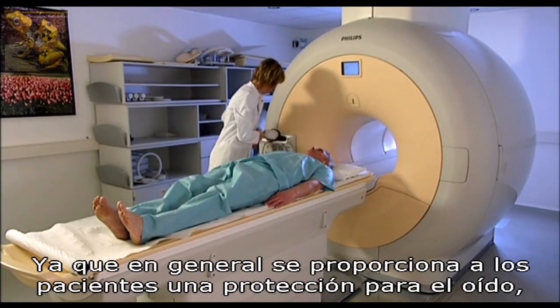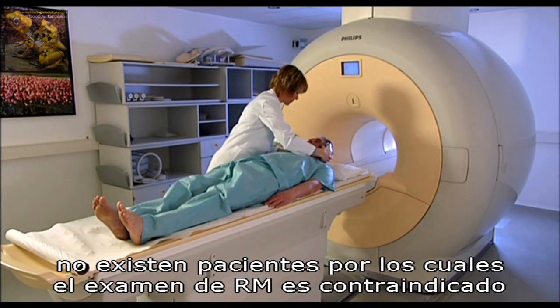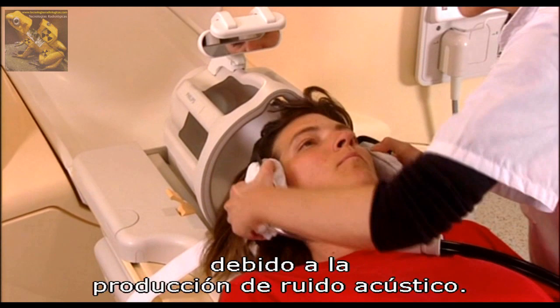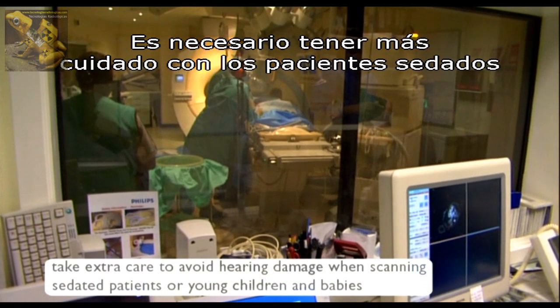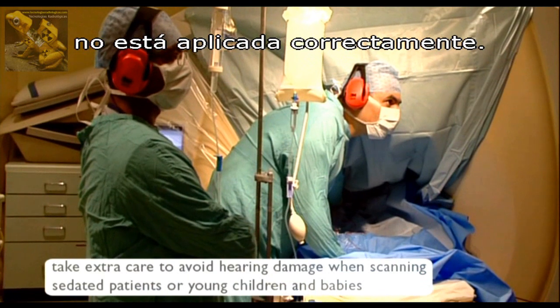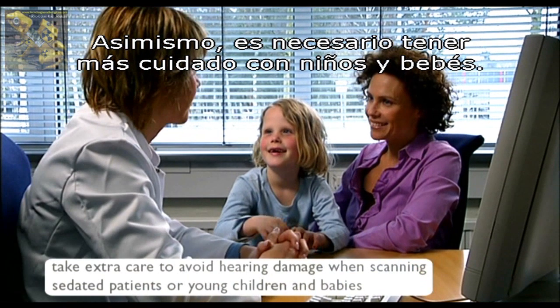Contraindications. Since all patients can usually be provided with hearing protection, there are no patients for whom an MR examination is contraindicated in view of the acoustic noise production. Extra care must be given to sedated patients because they cannot indicate that the hearing protection is not applied correctly. Similarly, extra care is needed for young children and babies.